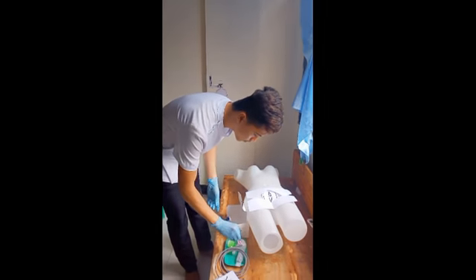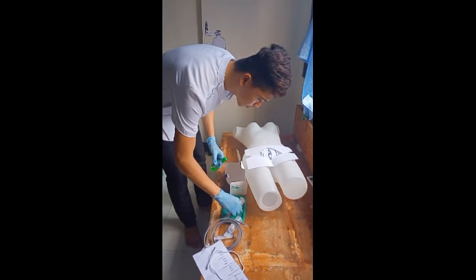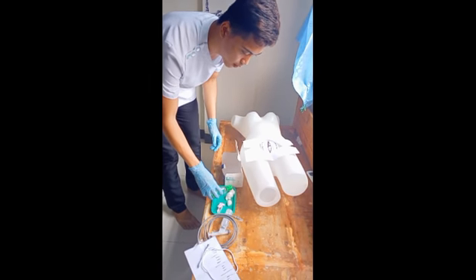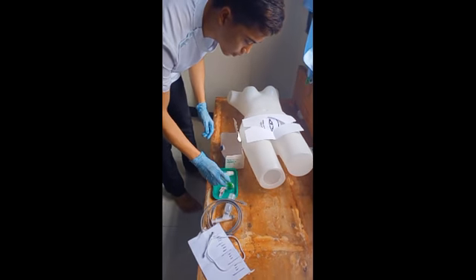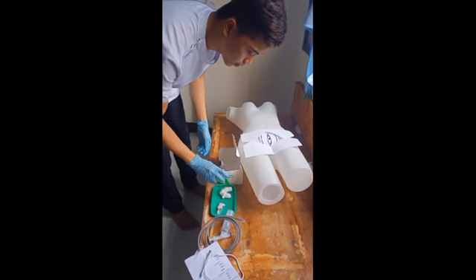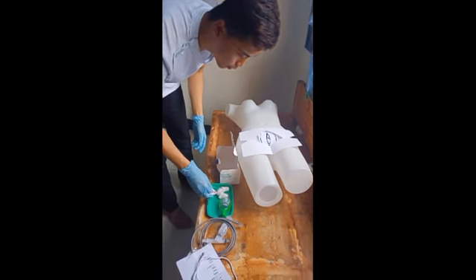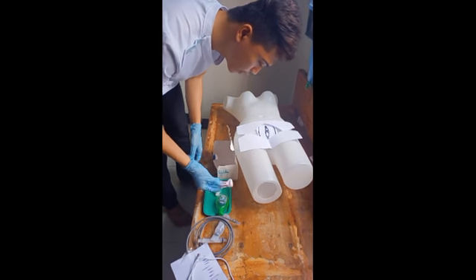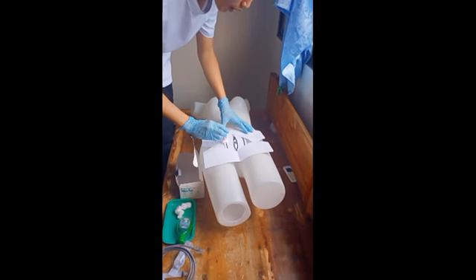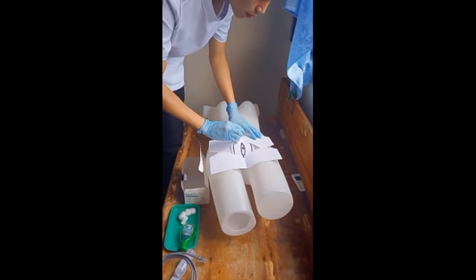So you need to put some betadine on the cotton balls. Let's assume I put some betadine. The next is you need to clean just like this. To clean the outside is like this.